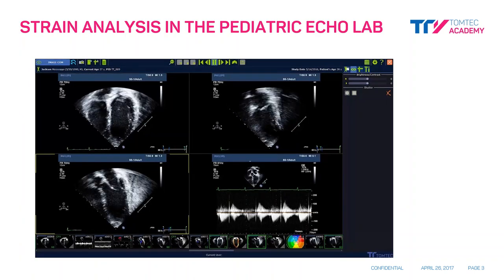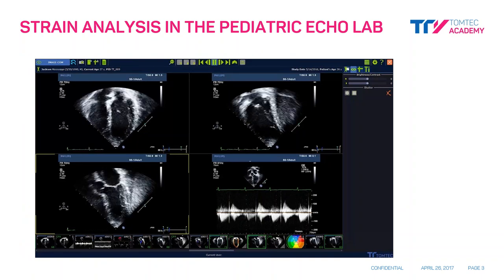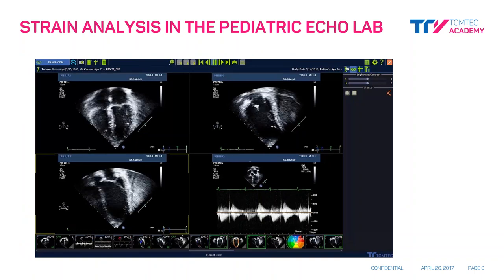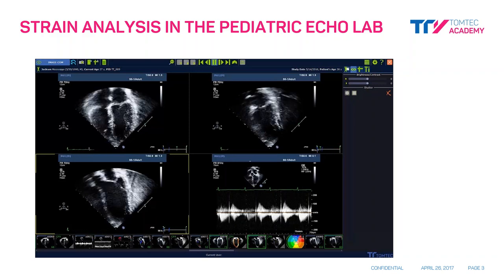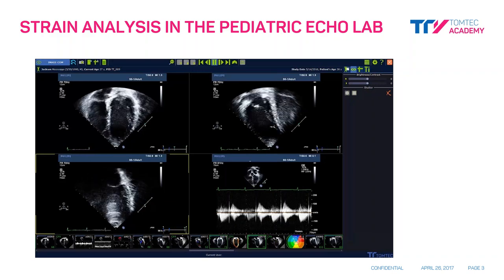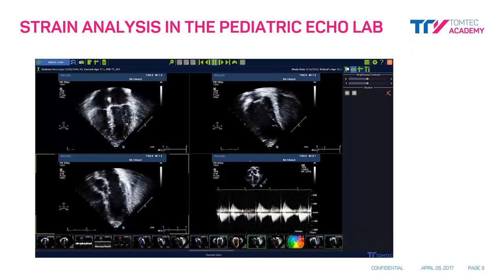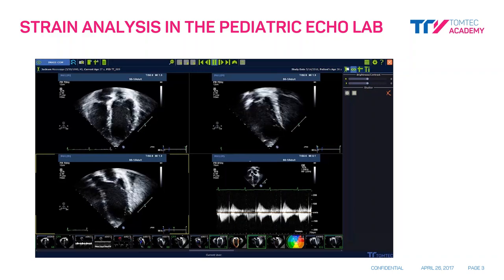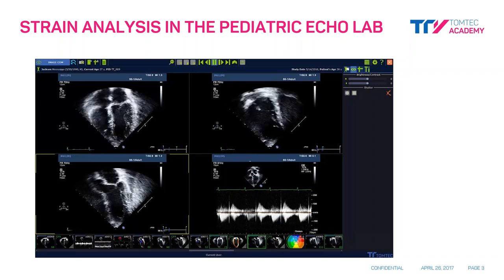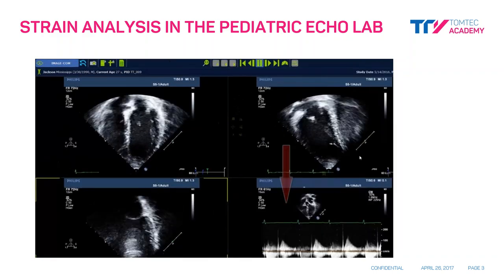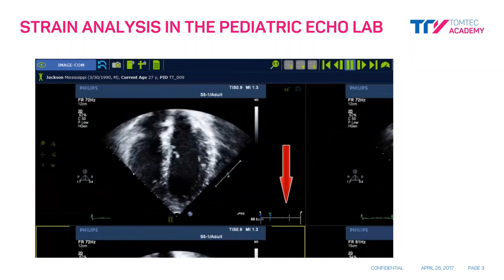Once the desired study has been selected and all three of the apical views, or any view wished to be analyzed, has been pulled into the viewer, the user can begin the analysis. If the user wishes to include the aortic valve closure time, he or she must also select an appropriate spectral analysis clip as well. If multiple cardiac cycles have been acquired, as in most cases, the user will select the desired cycle of choice by referring to the reference markers located just right of the ECG.